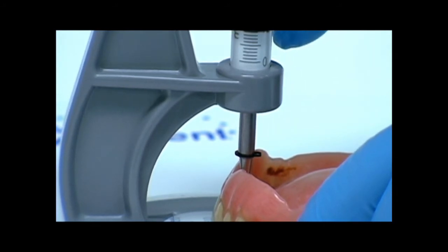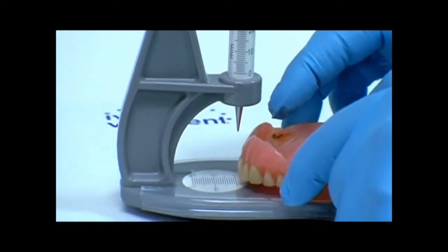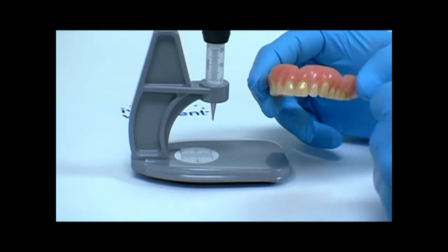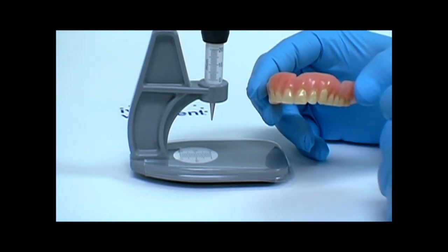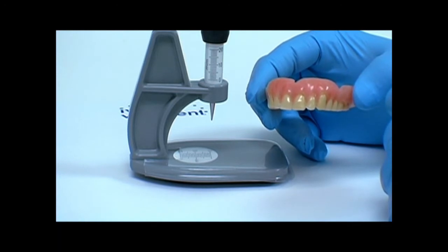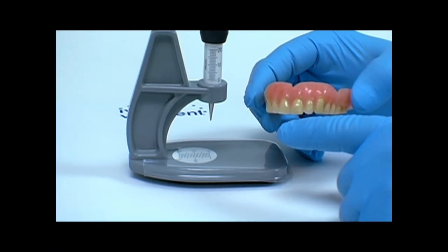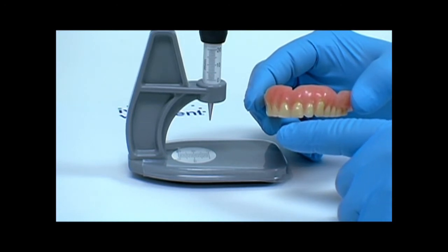Now I communicate that to the laboratory, and the laboratory will use that information appropriately. Because I've had the opportunity to try this into the patient's mouth, I realized that these teeth are shorter than I want the final teeth to be or the wax rim to be. So I'm going to take that 8 millimeters and add 3 millimeters to it, because I want my teeth to be at least 3 millimeters longer than what they are here.